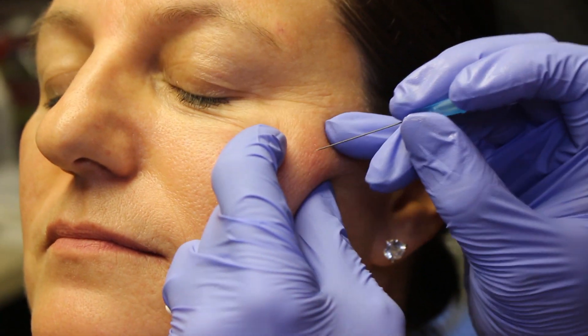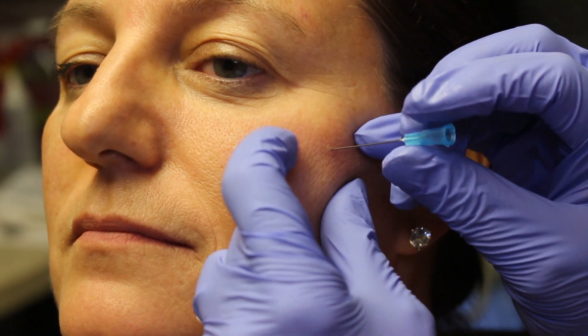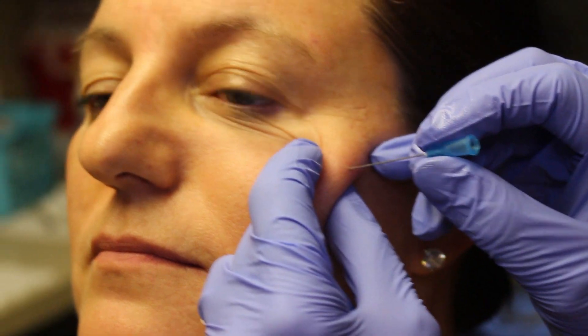So we're going to go in this area, which is where we did the initial aliquot of Voluma. Tiny little poke. You okay? It shouldn't be too zingy. This is just a little space to introduce the cannula.